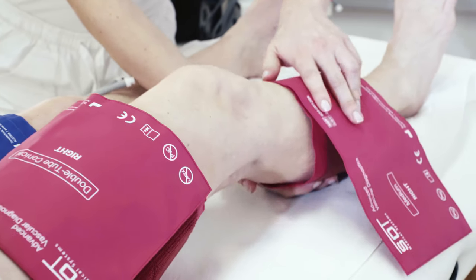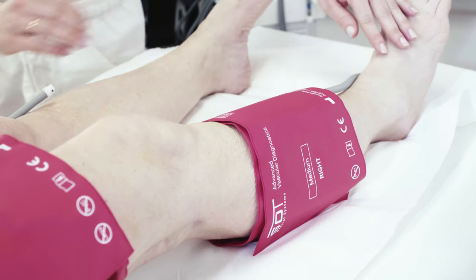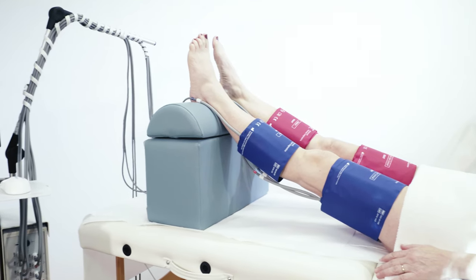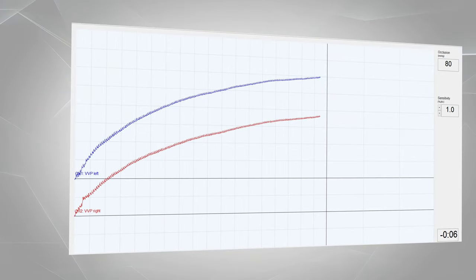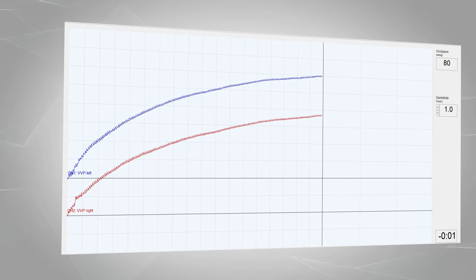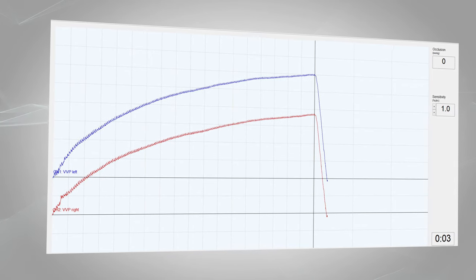When venous occlusion plethysmography is performed, cuffs are applied on thighs and calves, and the legs are positioned above heart level. The thigh cuffs are inflated to 80 mm of mercury to prevent venous drainage and not affect the arterial inflow to the calf. The calf cuffs serve as a highly sensitive probe.